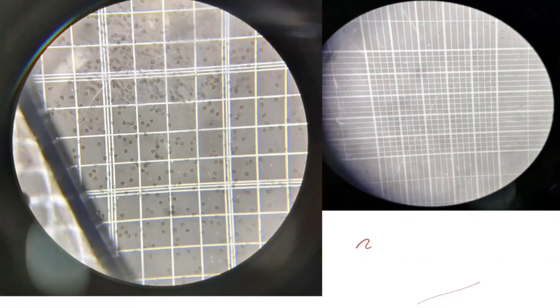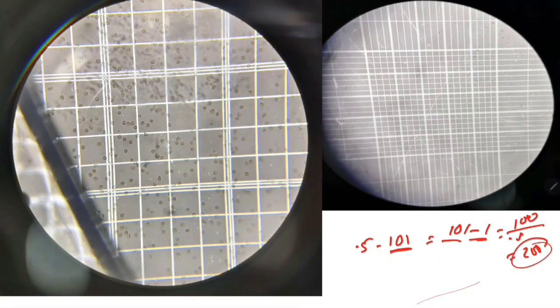So first we'll take 0.5 blood, then up to 101 fluid, then the stem part will be discarded, 101 minus 1, the stem part will be discarded, then the final volume will be 100 and blood will be 0.5. So total dilution is 200 times, and then we'll charge it after discarding the stem part under the microscope at 40x and focus it, and we'll get the cells like this.